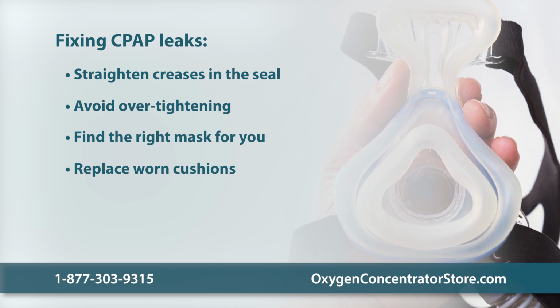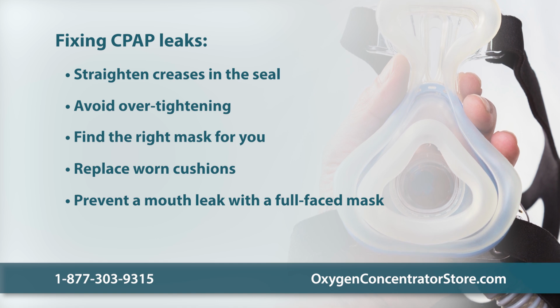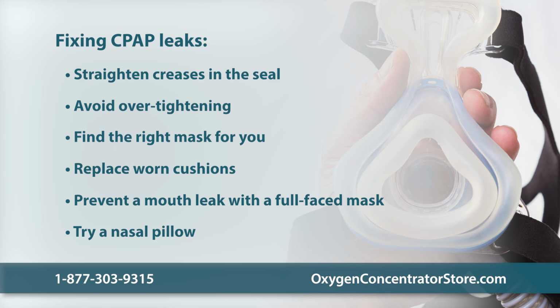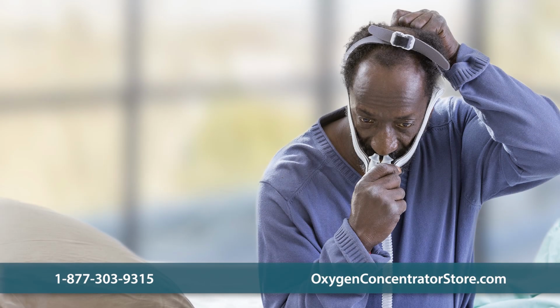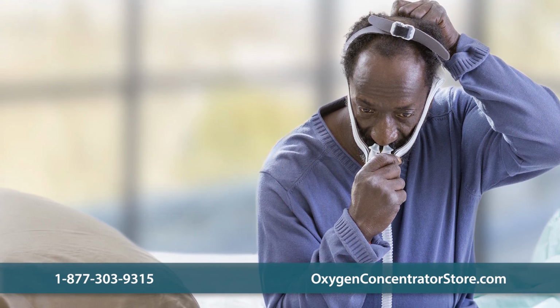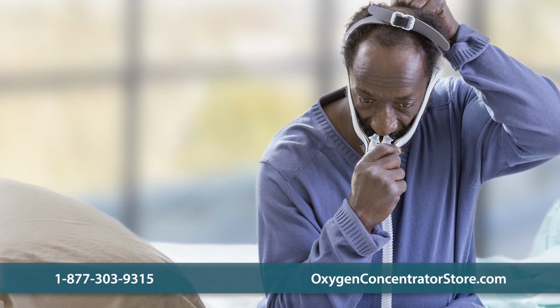Now let's look at fixing a mouth leak. Consider switching to a full-faced mask if you breathe from your mouth. Another solution is using a special nasal pillow called a CPAP pillow, which is shaped to prevent leaks. If leaks continue despite adjustments, it may be time to replace your mask components. Regular replacement helps ensure proper therapy and better sleep quality.